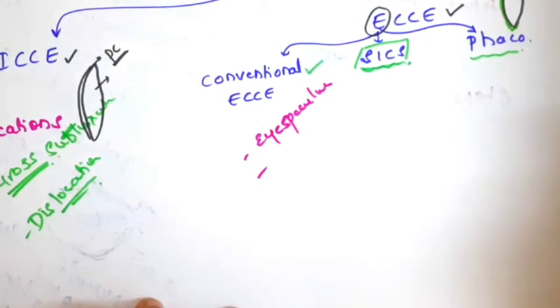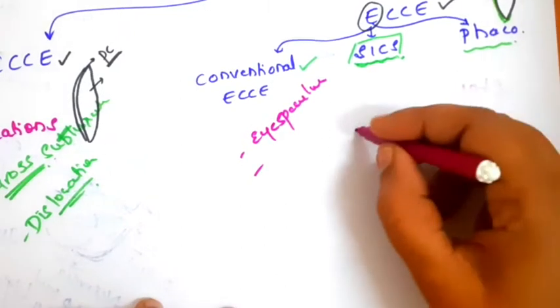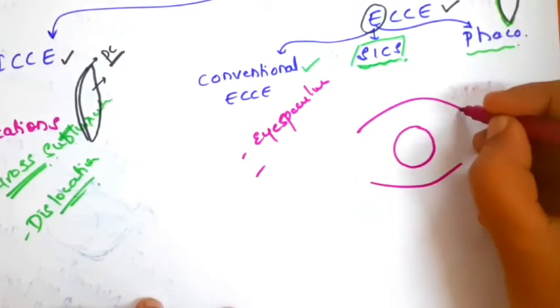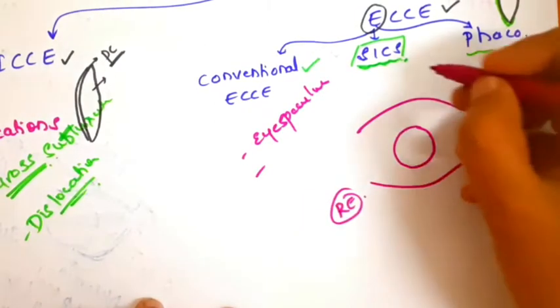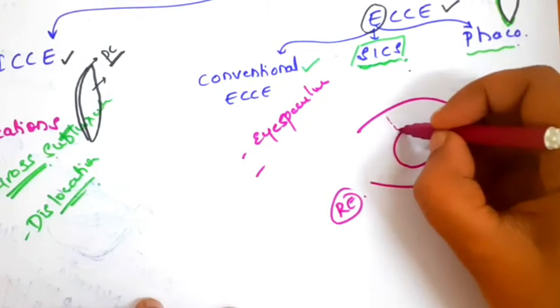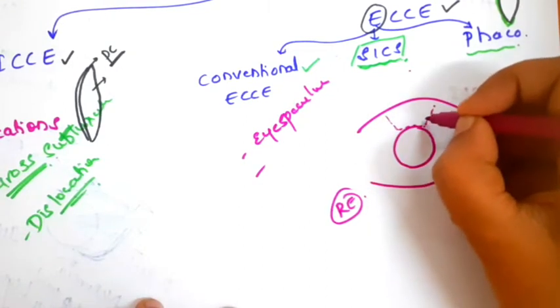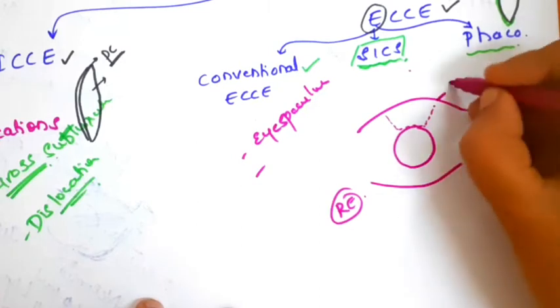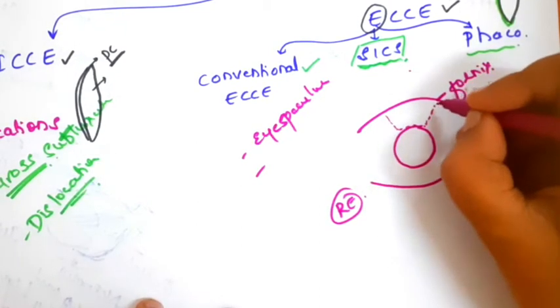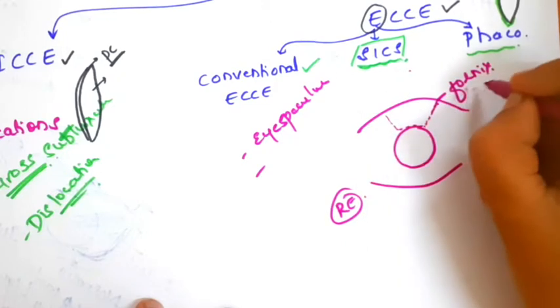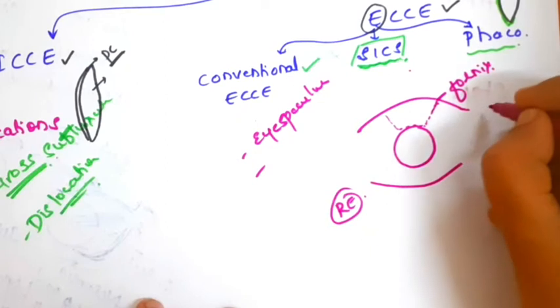Then we make a conjunctival flap, where the conjunctiva and Tenon's capsule are separated from the sclera. This is the right eye of the patient with the surgeon sitting here. The conjunctiva is averted back — this is called the fornix-based conjunctival flap, since it is attached at the fornix, which forms the base. One more is the limbal-based conjunctival flap, where we open in the fornicial conjunctiva and turn it over the cornea.